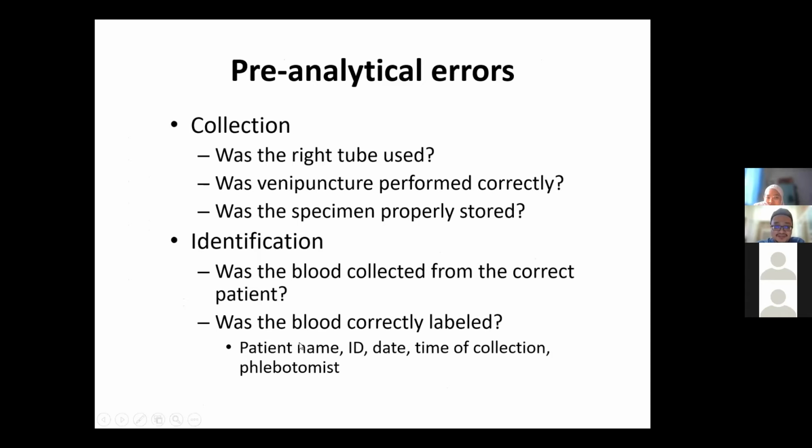Tadi cakap pasal collection. These are the questions you need to ask when we do the collection. Was the right tube used? Was venipuncture performed correctly? Was the specimen properly stored? And this is the reason why you have a specific class on phlebotomy, and why we have a specific phlebotomy session. Yeah. Identification, was the blood collected from the correct patient?